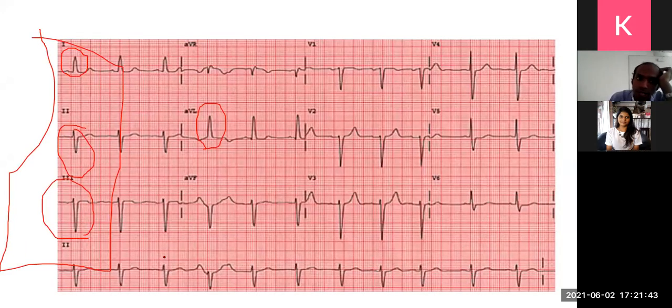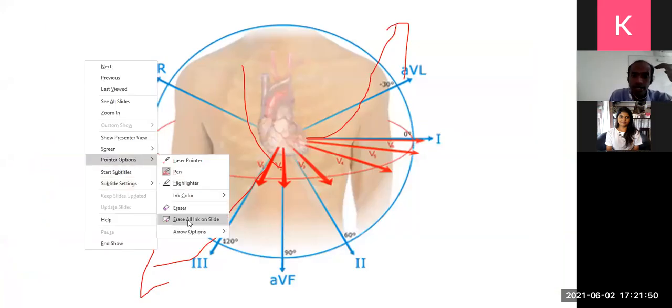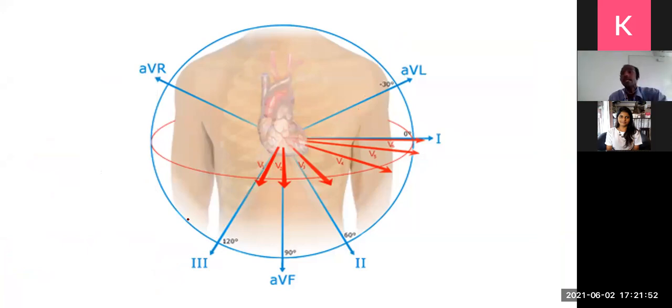Yeah, just a minute for that, just to grasp this. This is very important. Without this, you cannot understand anything about an ECG, especially the cardiac axis. Make a product and then you can obviously determine where the axis is going, right?